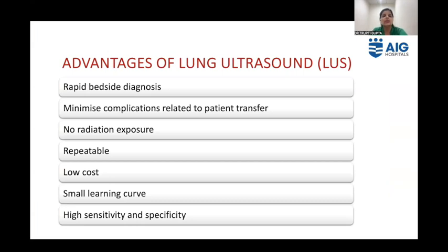So what are the advantages of doing lung ultrasound? It is a very rapid bedside diagnostic tool, minimizes the complications related to patient's transfer, no radiation exposure, it is easily repeatable with a very low cost, small learning curve, and high sensitivity and specificity.